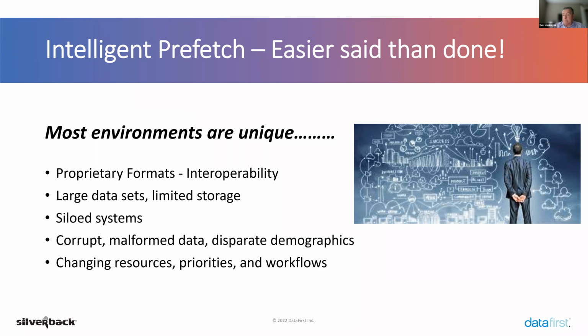Large data sets. Again, we touched on the exams just getting bigger. In intelligent prefetch, we can handle that by just giving thick slice data if that's appropriate to end users, archiving the thin slice data somewhere else, et cetera.